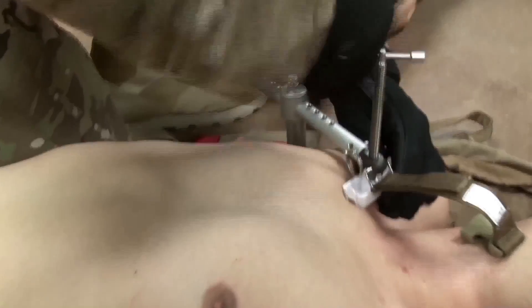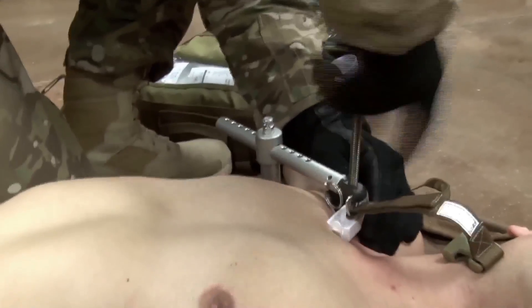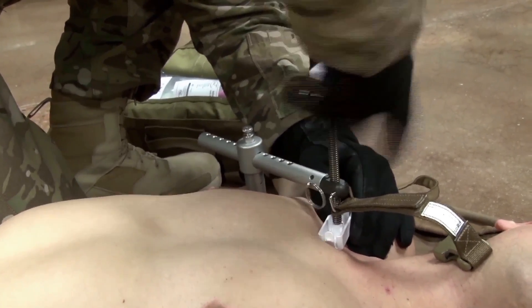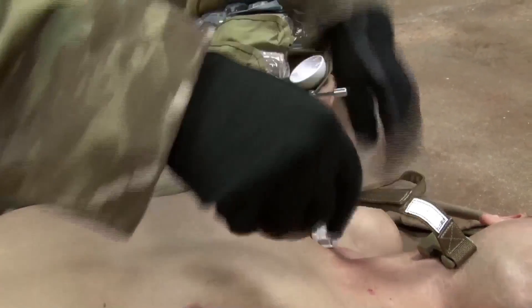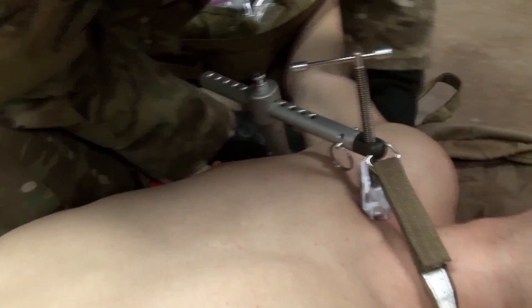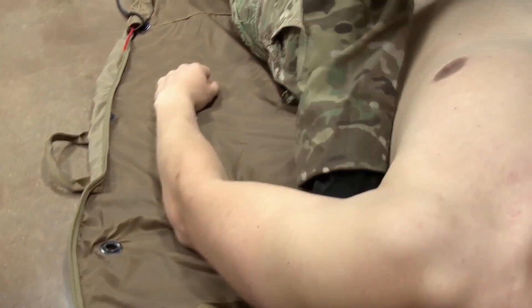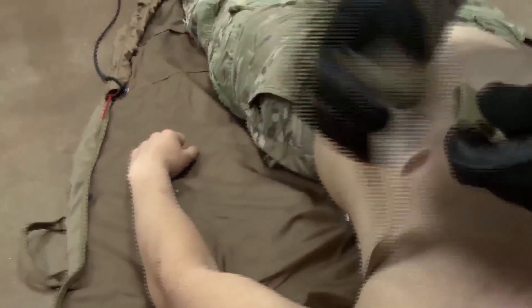The pressure disc should not make contact with the clavicle. Apply pressure by turning the T-handle clockwise. Apply pressure until the bleeding stops. If hemostasis is not achieved within 20 full turns of the Croc, consider releasing and repositioning the pressure disc. Route the securing strap underneath the uninjured arm and attach to the clasp. Write the time of application on the label.